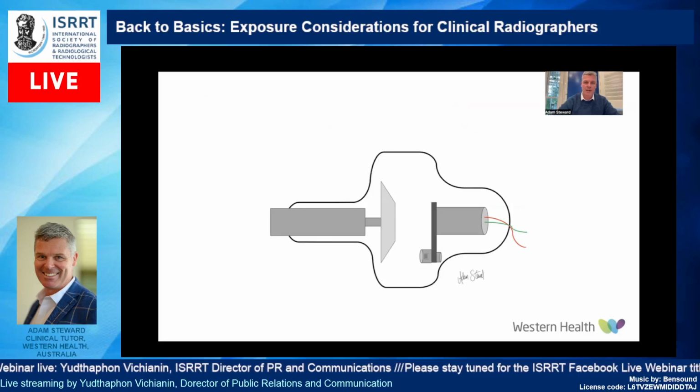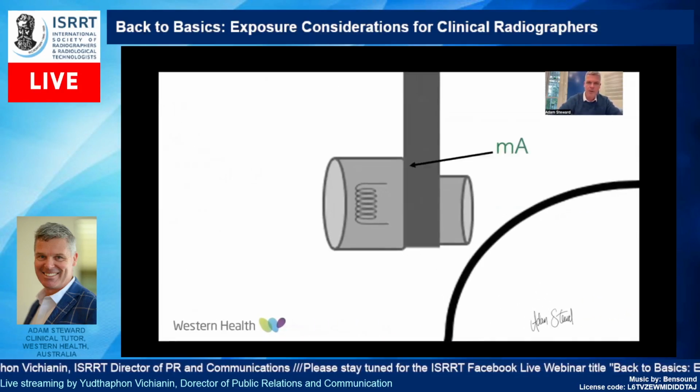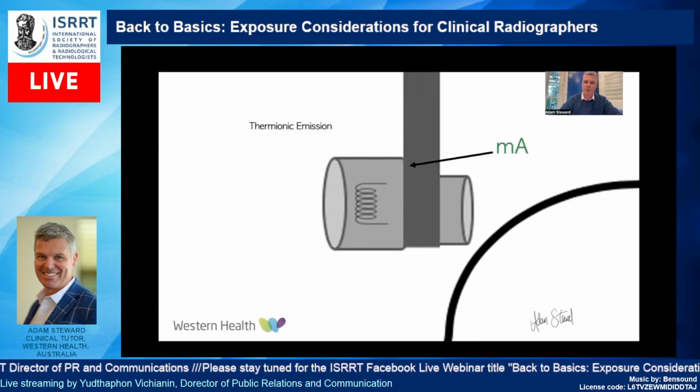Now, when we apply it to the cathode, basically it goes along this little filament. The filament heats up, and via a process called thermionic emission, a lot of electrons are ejected from their atomic state. Because we have the vacuum, they're free to move around. They're not taken up by particles in air or whatever else. They're free to move and free to roam.